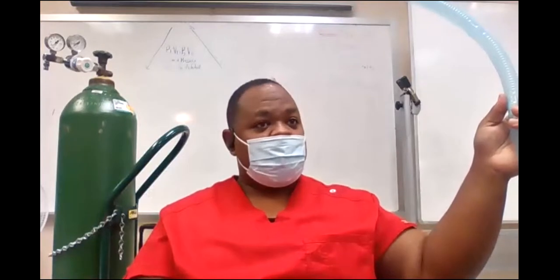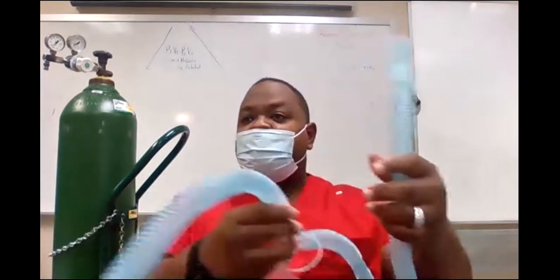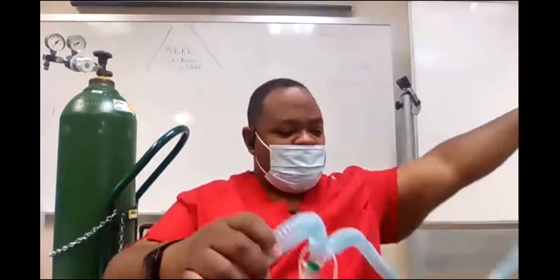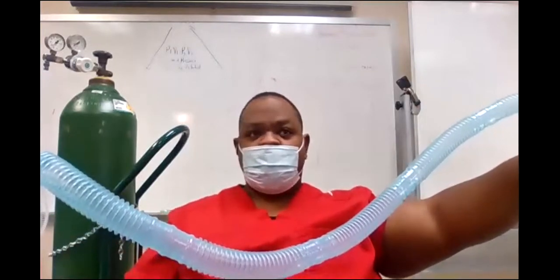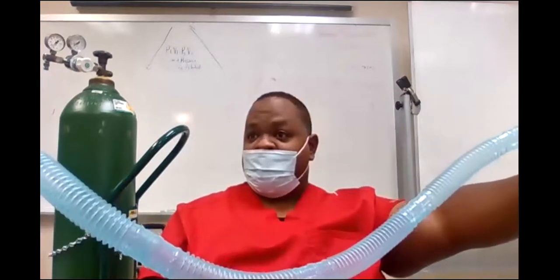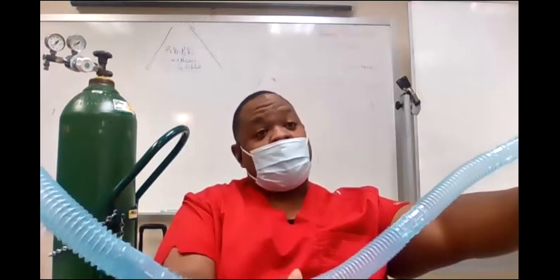And this goes to the patient. Simple as that, okay? You have sections on these large bore tubings that you can cut, okay? So you usually try to put the bag wherever the trough is. If I have a patient on it, just say this was all I had, where is the trough in here? Where is the water going to collect? Right here, right? So if I know that I got grandmama right here in the bed at home, and I have the system over here, and I see that this is where the water, if it starts to collect, it's going to collect right here.